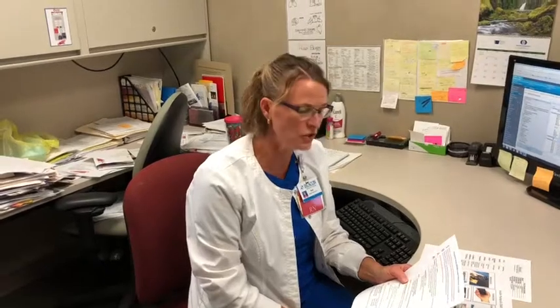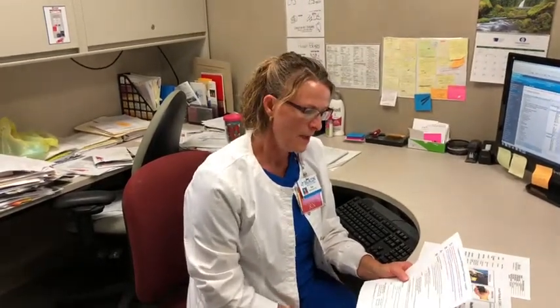If the patient has contraindications and refuses to take the pump off, you need to let the ED doc know and contact risk management immediately for what to do from there. If the patient does not have contraindications, they can continue to use the insulin pump during the ED stay.